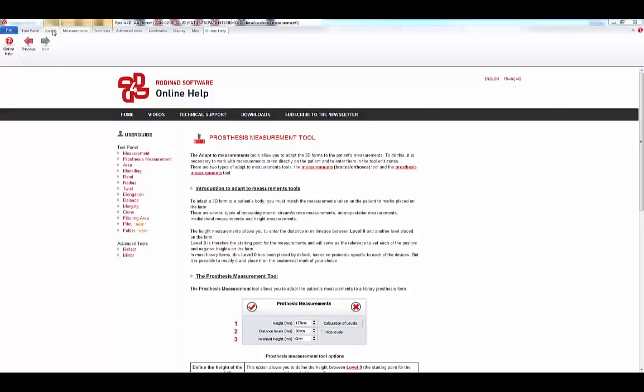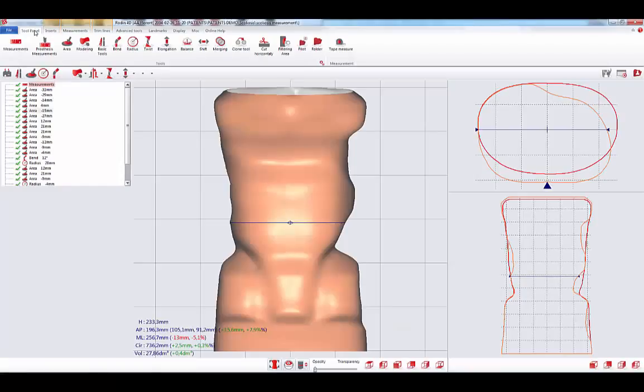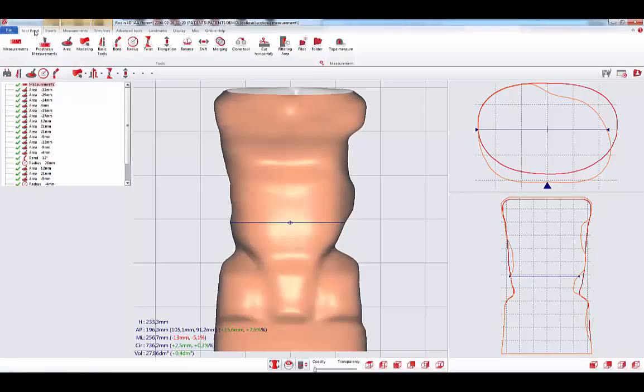To conclude, due to the reorganization of the interface, every functionality is accessible within two clicks. And with the Help Online, everything is done to make the use and the learning easier.